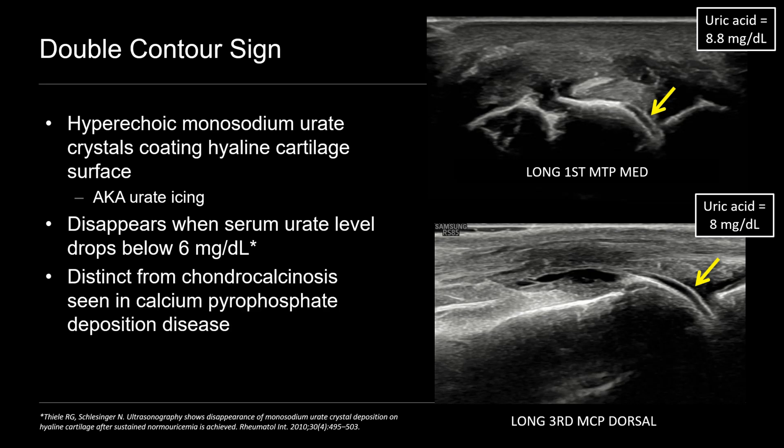This is also distinct from chondrocalcinosis, which we see in calcium pyrophosphate deposition disease — CPPD arthropathy. In that case, you'll see echogenic crystals within the cartilage, within the anechoic hyaline cartilage, as opposed to on the surface. So you can differentiate the two on ultrasound.